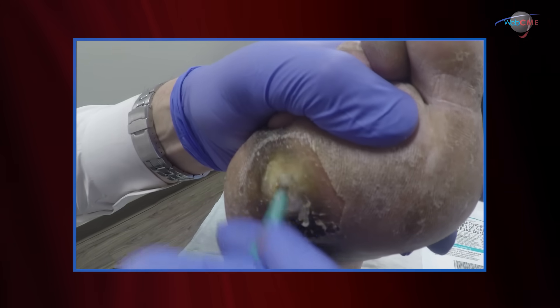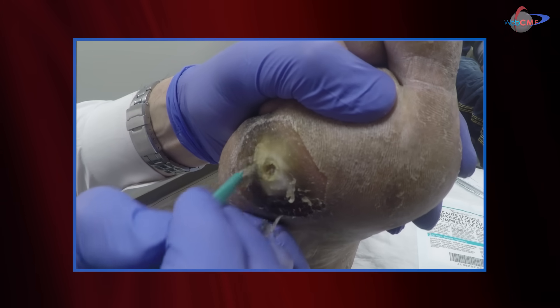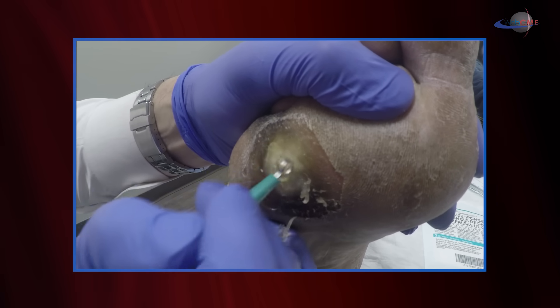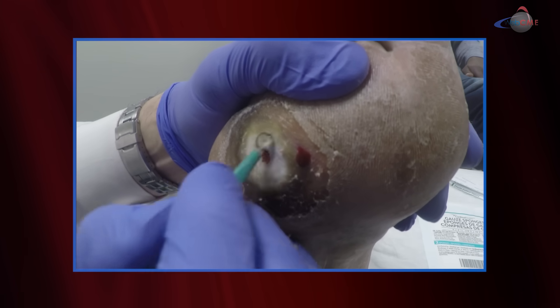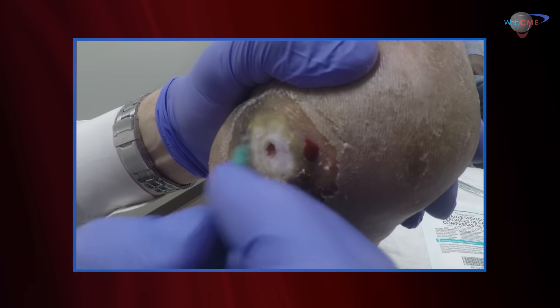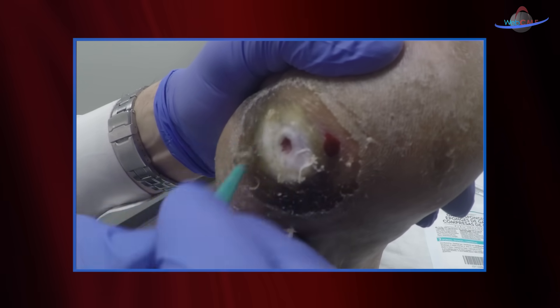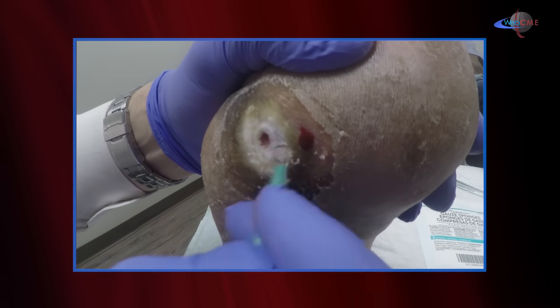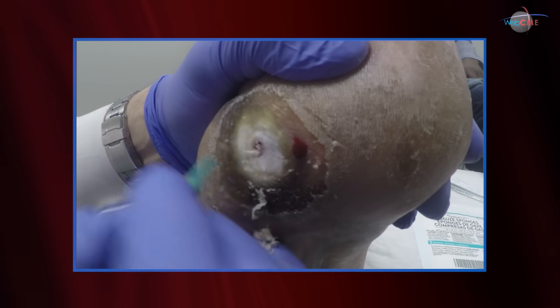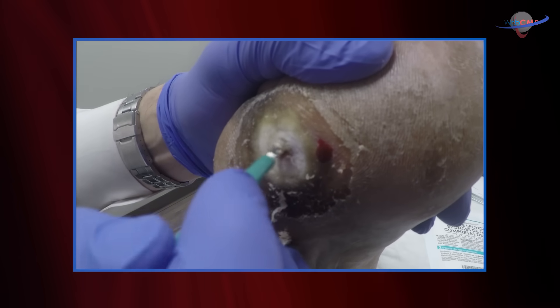Once you've debrided the callus around the area, we start working centrally to again determine if there's an ulcer and, if so, the extent of that ulceration. What you'll see is that this is certainly through the dermis. When we have an ulcer lesion that violates only the dermis, we have a Wagner 1 ulcer. When that ulcer extends into the subcutaneous tissues or involves deeper structures, we have a Wagner 2 ulcer.